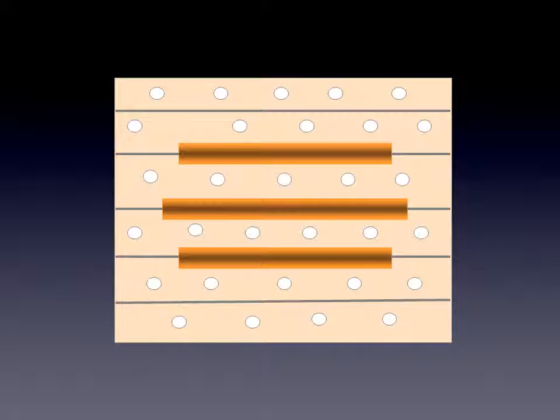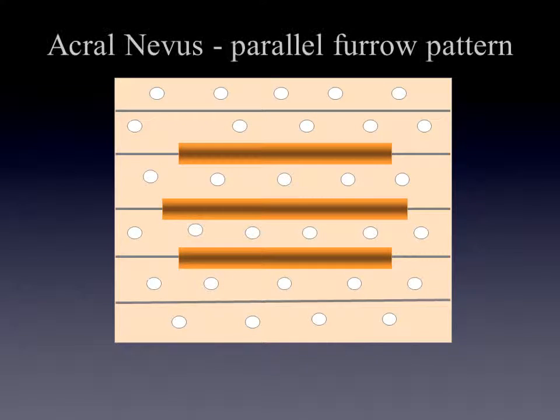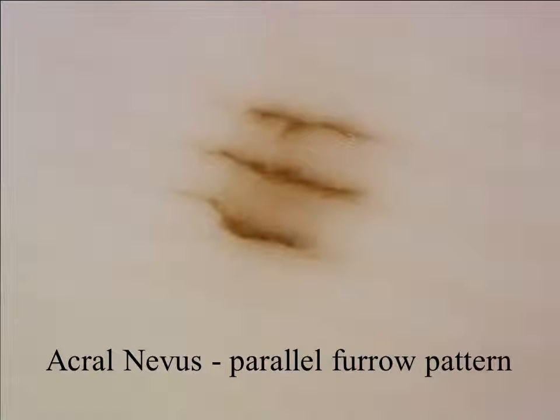If we have pigmentation, we look whether this pigmentation is in the furrows and if it is distributed in a parallel way. If this is the case, we have a stereotypical acral nevus with the so-called parallel furrow pattern. Here we see an acral nevus with the parallel furrow pattern.